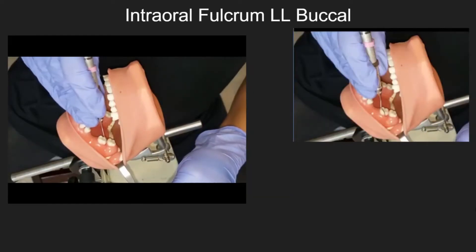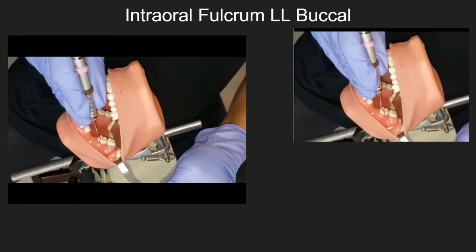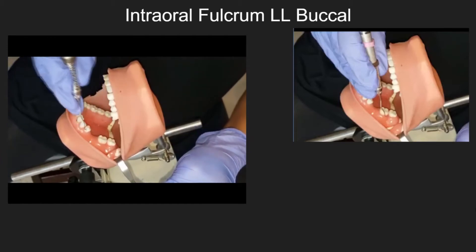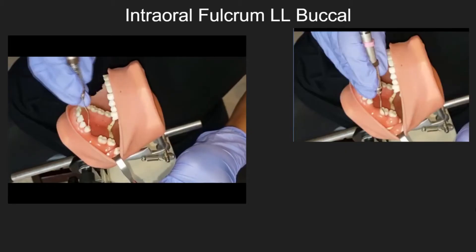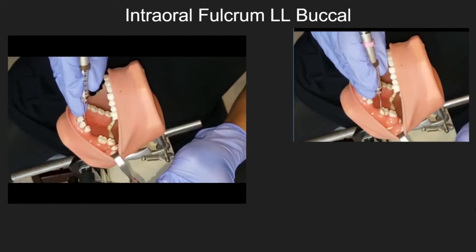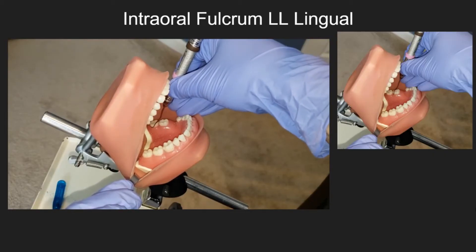Intraoral fulcrum — lower left buccal. Intraoral fulcrum — lower left lingual.